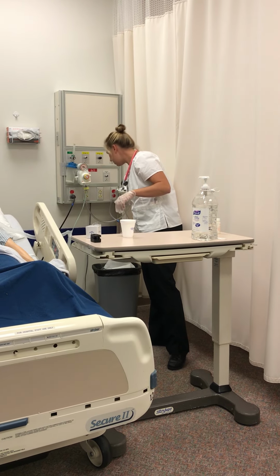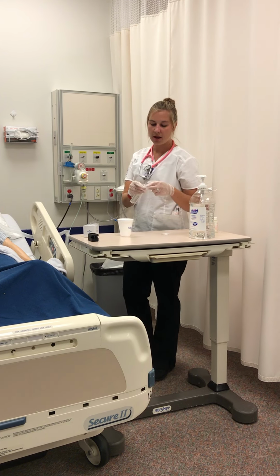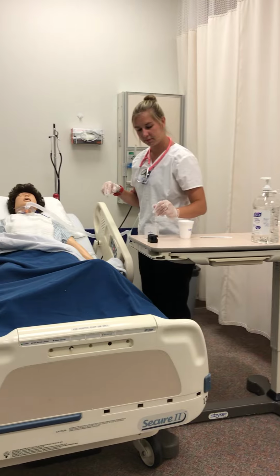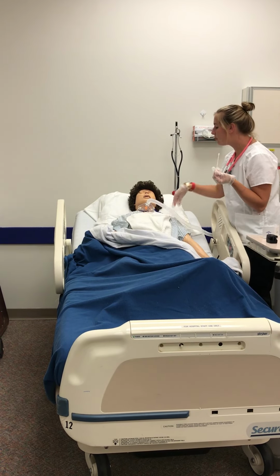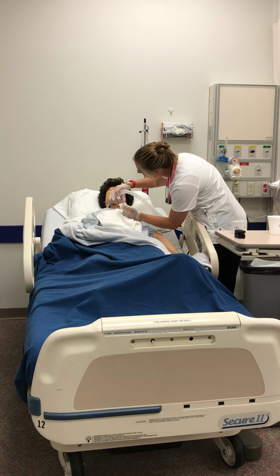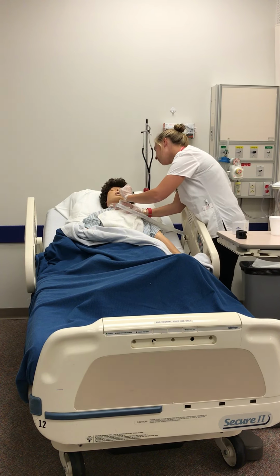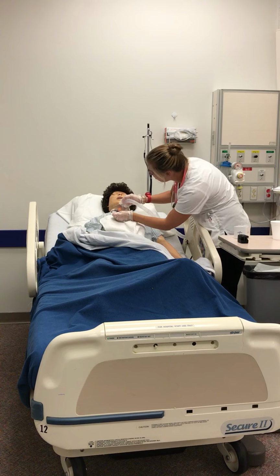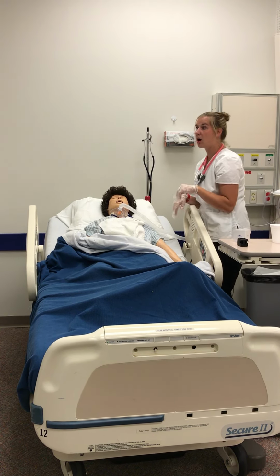All right, the next thing I'm going to do, Gretchen, is clean that trach area with a cotton swab and saline solution. So I would remove the gauze that's around the trach at the moment and throw it away. And then I would clean the skin around the trach with the cotton swab. And then replace with a new gauze.